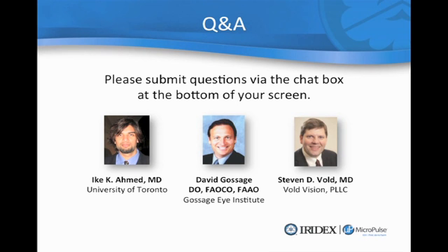But from the standpoint of ease of use, it's a very user-friendly laser. The 300 micron spot size covers the trabecular meshwork very well, and basically you're just doing confluent laser spots, one right next to each other, for 360 degrees. I use a Ritch 4-mirror lens, so typically I'll do about 25 pulses for each quarter within the 4 mirrors, and you end up getting about 100 pulses, anywhere between 95 to 110, with one full treatment.